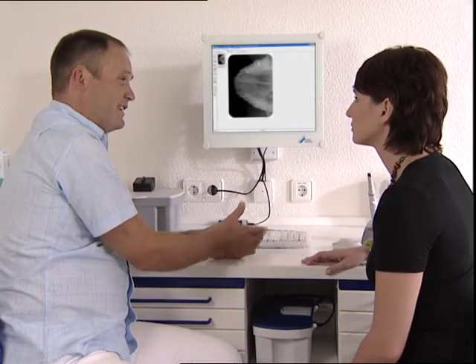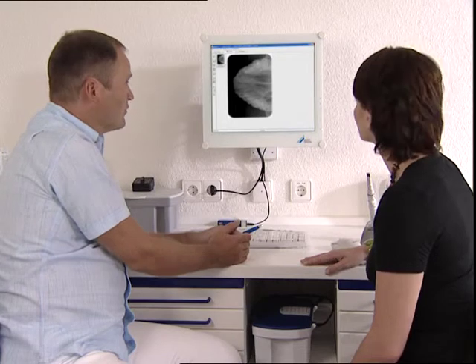The zoom and measuring functions will support your arguments during patient consultations.